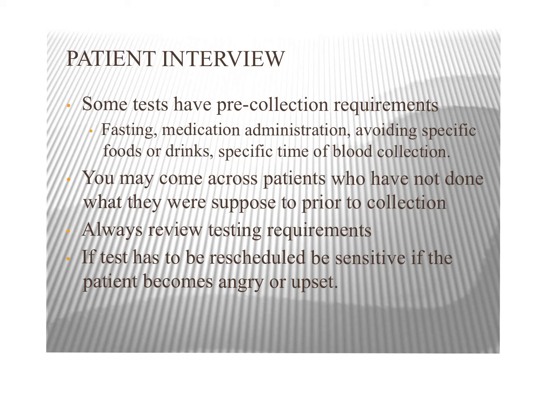We might come across patients who have not done what they're supposed to do prior to collection. So it is very important that we ask if they've done their pre-collection requirements. If they have not, then we need to wait to draw and contact whoever made that order, so the physician or the nurse practitioner or the physician's assistant, and see if they want us to draw, or if they want us to reschedule.